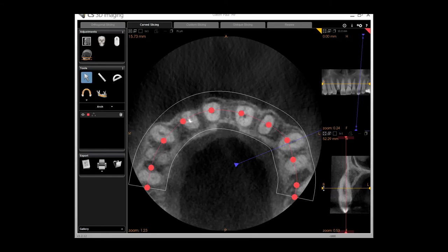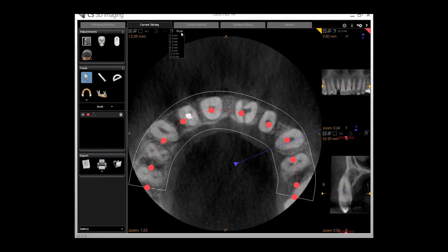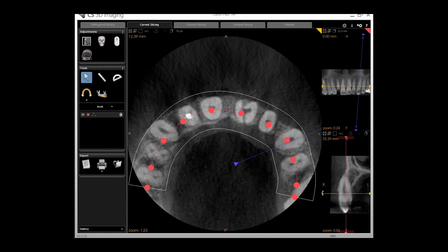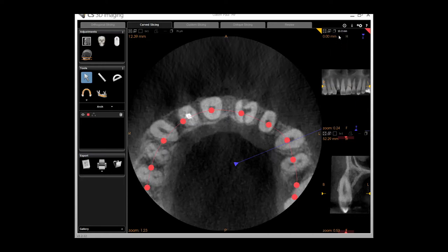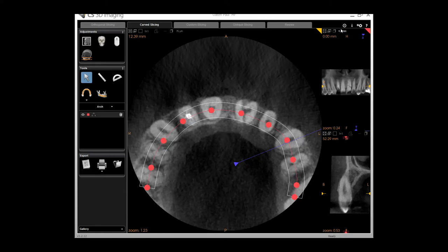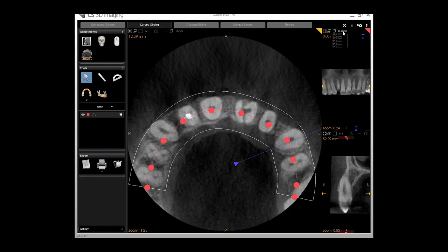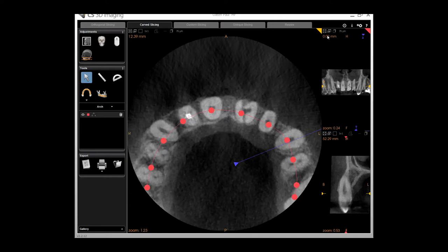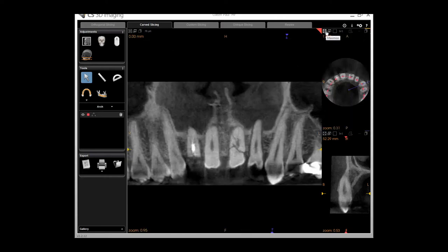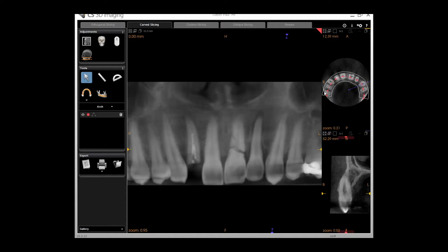As far as thicknesses are concerned, you will see a different orientation of thicknesses here. The white line which surrounds the arch will get bigger and smaller as I change the thicknesses in the scan. I will also pass upwards through the teeth at different angles — see the white line disappear. As I change the thickness, the white line increases and gets wider to show you an interpretation of how wide the slice is for the top right-hand box. I can also move the arch out of the way to get a better view and pass through vertically, giving me a better appreciation of the scan.